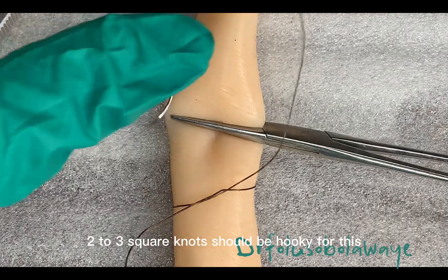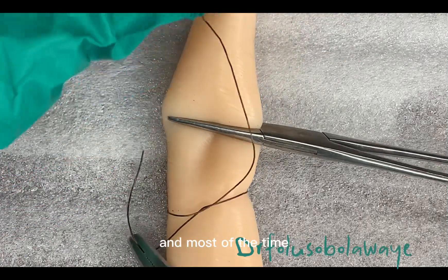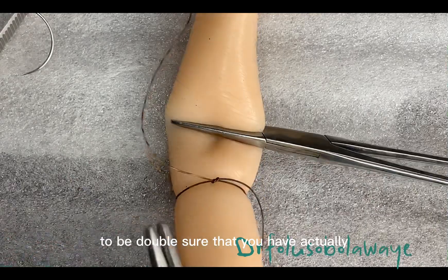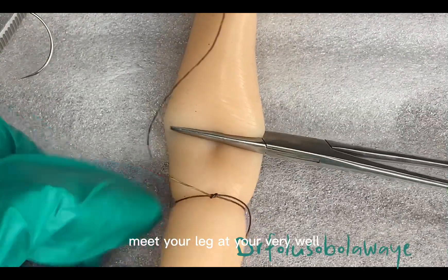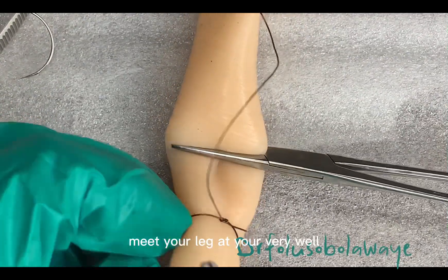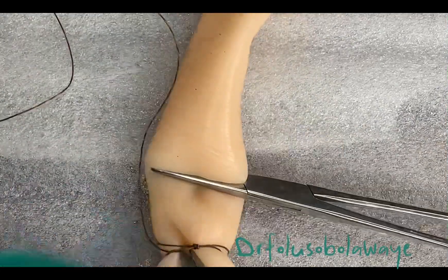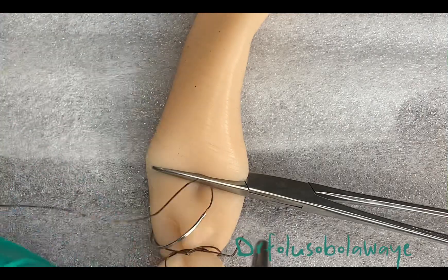Two to three square knots should be okay for this, and most of the time you can actually take it round again to be double sure that you have actually made your ligature very well. So once this is done, all you need to do is just to cut away the suture material and you are done.